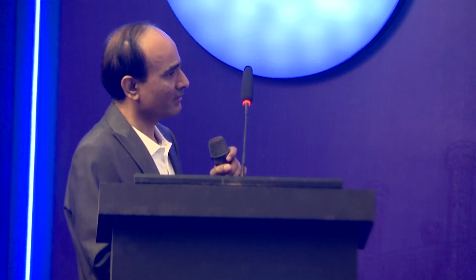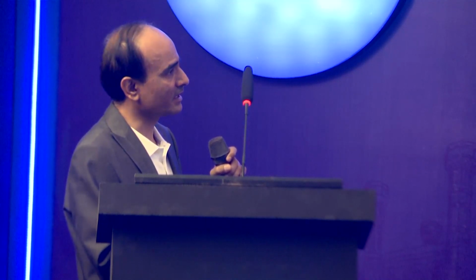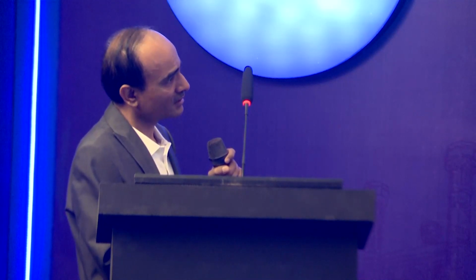These 2 balloons were now in line, and we wanted to push it into the apical LAD so that we can have a small apical infarct, but get rid of this left main balloon. But as you saw, the guide kept coming out, this was sticking here, and the other balloon was not able to push this into the distal LAD either.